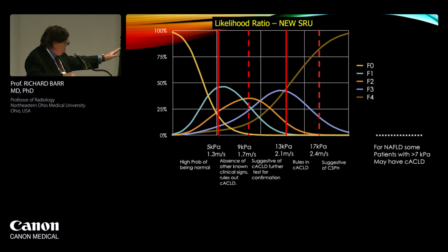And if you look at this table, you'll notice between 5 and 9, the vast majority of those people have what we were calling F1 and F2 disease, mild or moderate fibrosis. But when we get above 9 kPa, notice that we are now getting a lot more people that have severe fibrosis or cirrhosis. So again, you have to take not only this information, but all their other clinical information, put them together to decide where the patient's at.